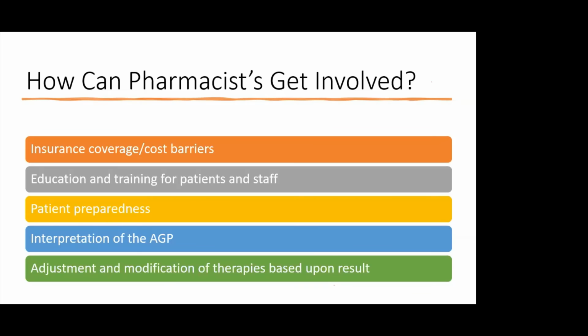And I think even without our intervention, sometimes patients just take advantage of having that constant feedback to then educate themselves, right? It's like, hey, if I eat this, this is what happens to my blood glucose. So then, instead of us telling them, hey, avoid these things, or watch your portion size of this, they see it for themselves and they kind of guide themselves to make better decisions. So all that, in a nutshell, is the benefit and the ways that we get involved with the use of the technology for the patient.